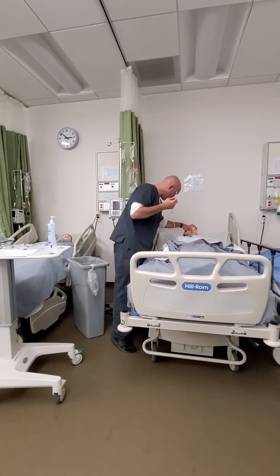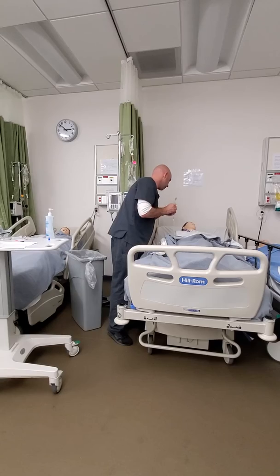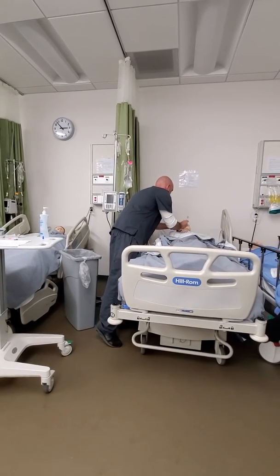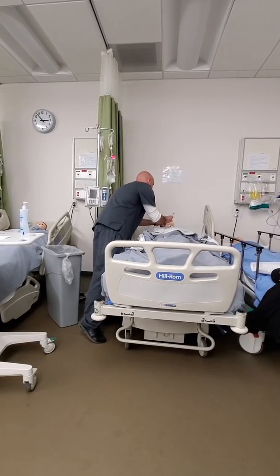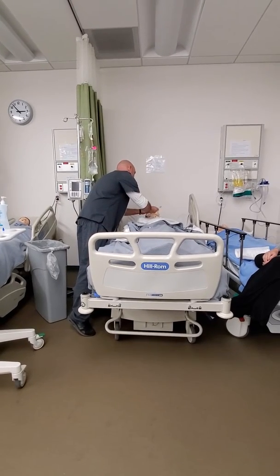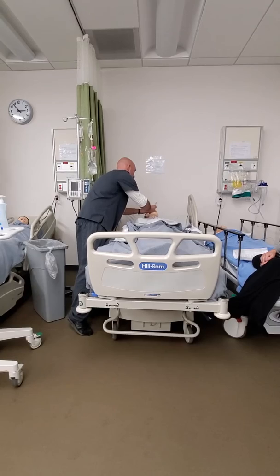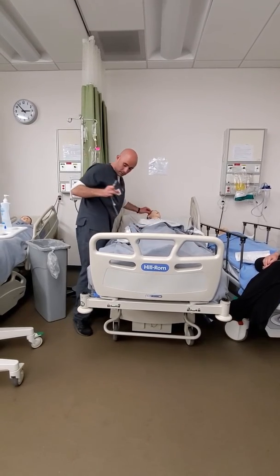I'm gonna connect it to this port, the proximal port. I'm gonna clean this for 15 seconds. 1, 2, 3, 4, 5, 6, 7, 8, 9, 10, 11, 12, 13, 14, 15. And I won't put trash on my patient.